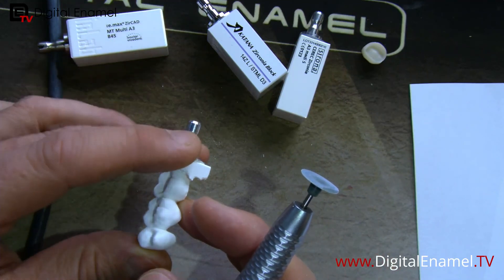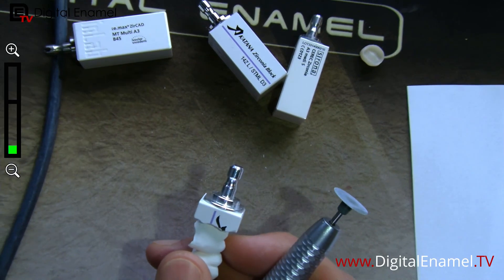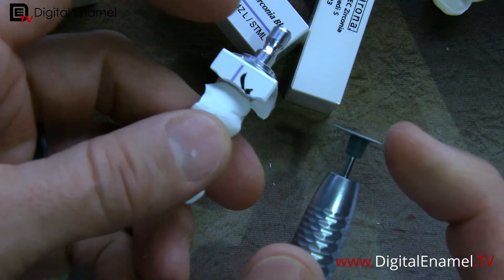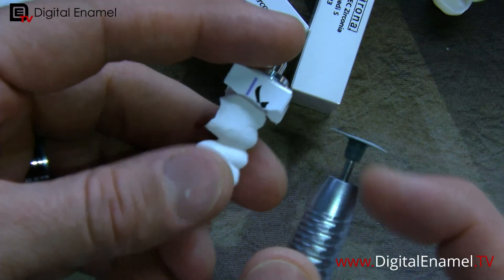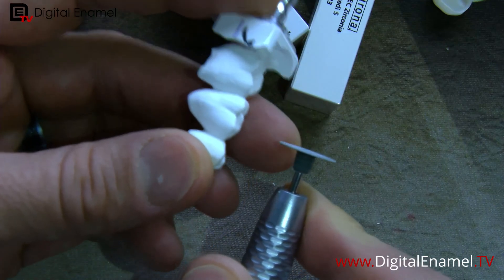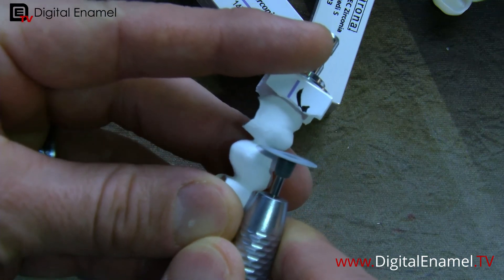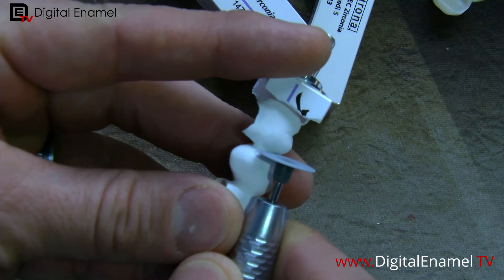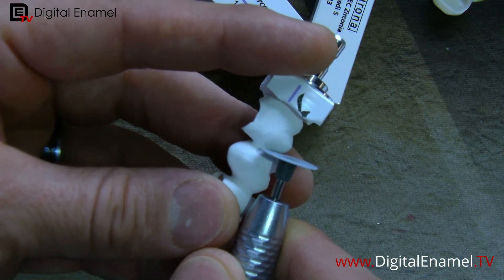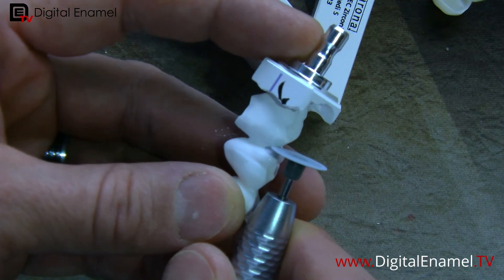This burr is very flexible — you use both sides of this instrument, either pulling it or pushing it. As I'm redefining this embrasure, you want just a little bit of RPM, not much. I'm going to put it into the embrasure and pull it towards you — you'll see it bend as it comes through, making a really nice transition. Instead of flipping the block all the way around you can put it in and push it too. You can see the flex of the burr and it tapers it out extremely well so the teeth appear separated.